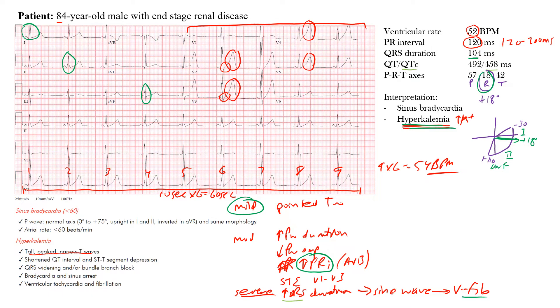The main findings to take away are hyperkalemia and its staged EKG changes — mild, moderate, and severe. In severe cases you may see QRS widening, bundle branch block or intraventricular conduction delay, or sinus arrest. In this case we see a rate of about 52–54 beats per minute, below 60 beats per minute. There is a P wave before every QRS complex, giving 9 P waves total, so the atrial rate is also below 60.